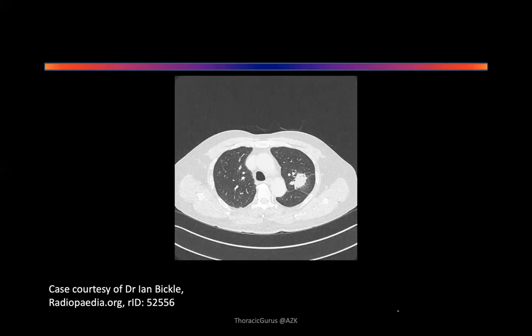Talk about the spicules and see the fissure is getting pulled. Can you see this? This is a classical tented fissure sign. Yes, the fissure is tented. This is really classical. You look at it and the diagnosis is most likely to be a malignant pathology. Yeah, so it could be lung cancer, we don't know, but it is malignant. Okay, well done. Yes. Excellent.